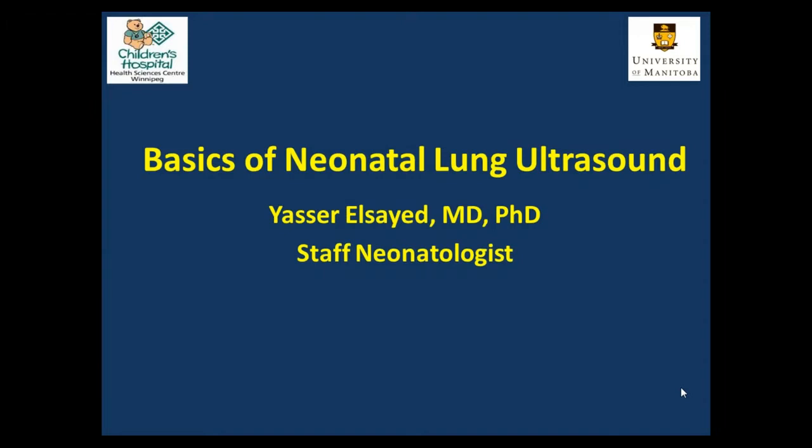In this presentation, I will discuss a new modality which has been introduced recently in neonatal care as a modality of point of care assessment of lung parenchyma. So this presentation is about basics of neonatal lung ultrasound, and it is just a brief introduction to this new modality.